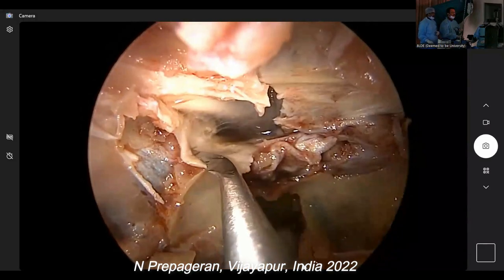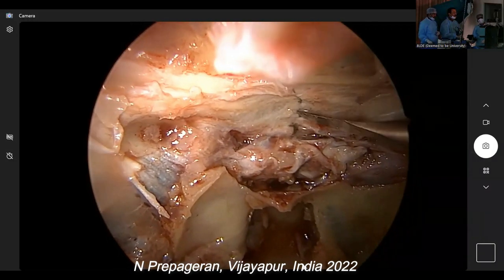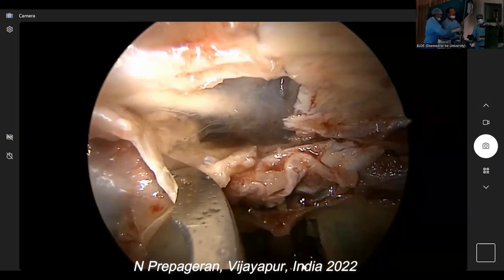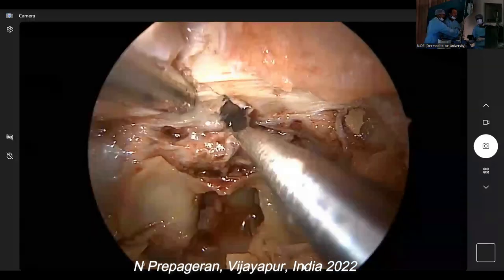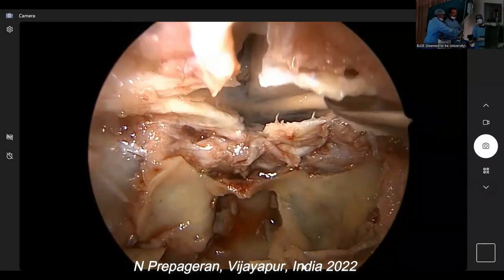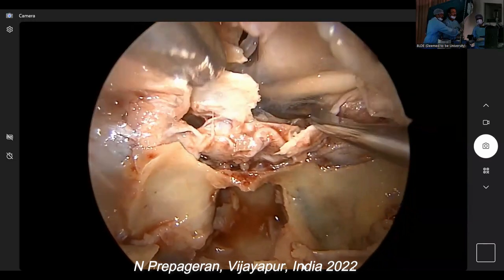And here, you can see the ophthalmic artery. Where is the ophthalmic artery? It will be just here. There. Beautiful. Can you see? Ophthalmic artery. Very clear. The same way, we're going to cut here now, and I'm going to cut along here. Your sickle knife is as sharp as mine at home. Okay. And ophthalmic artery.